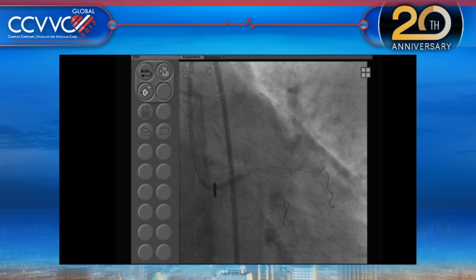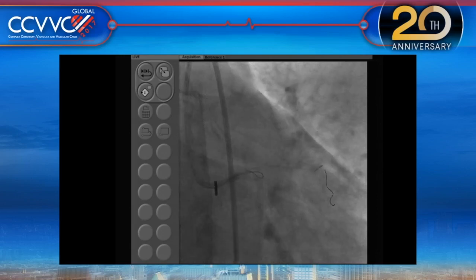Okay. Yeah, because the key is that it will be a big crush. You don't want that. You want a mini crush, right? You want it as low as possible. Any comments? Yeah, I'm not opposed to the 2.75. I like to stent to the distal vessel, and you can always post-dilate it higher up. I've seen too many vessel dissections and ruptures, especially in the distal area where you don't have the wire in the best possible place. You're absolutely right.